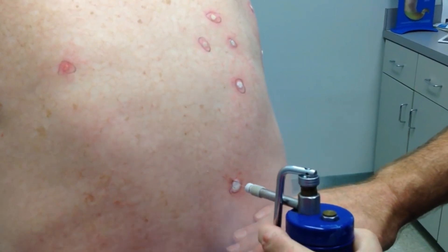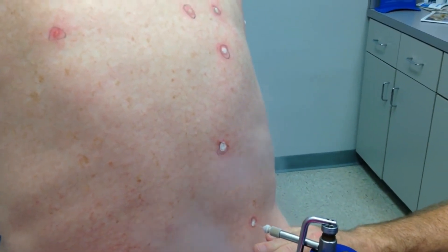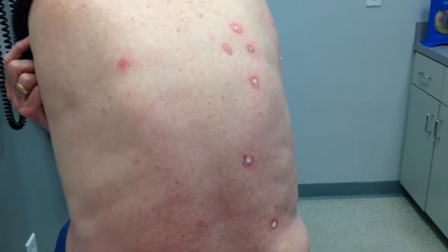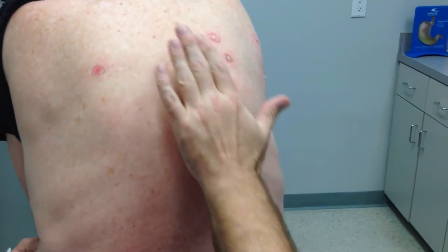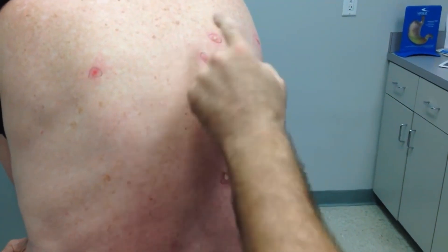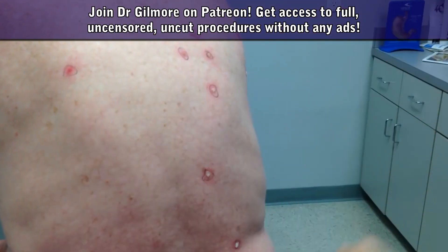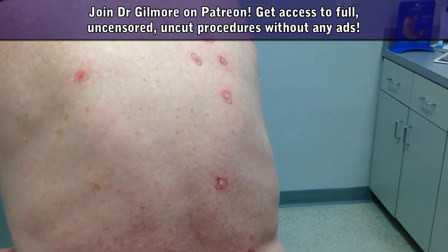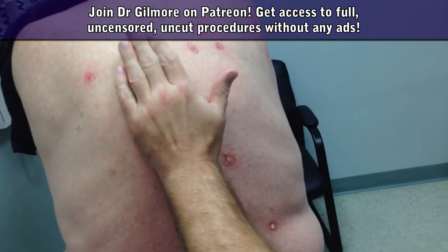It's burning in the middle but it's kind of cold around the edges, right? Just one more to go — this is the worst one. All right, we're done! These will get red and kind of angry looking for a few days. They'll dry up and the little raised part of the tissue will just peel off in time. There's no need for bandages — this will be just fine uncovered. Good work, you were a good patient.